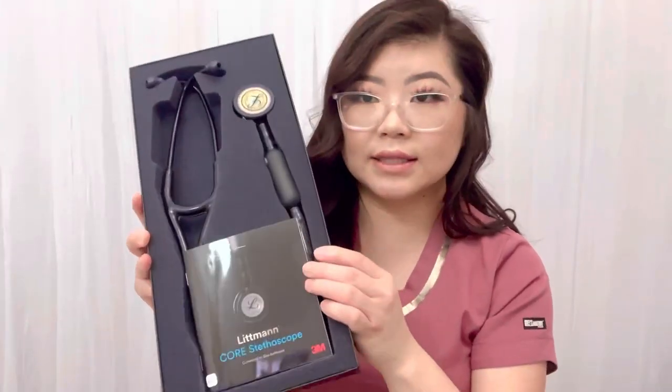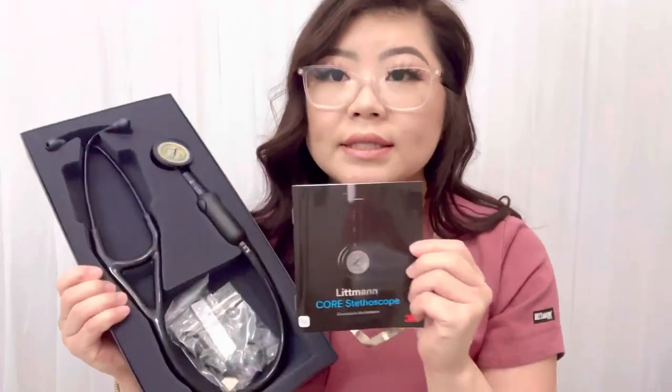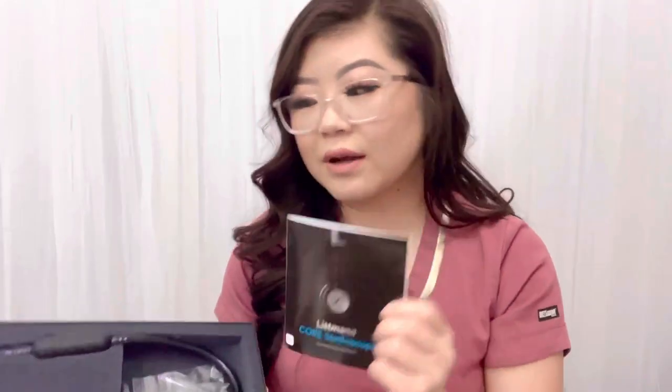When you open the box there's a little cushion cover and it looks like this. There aren't many colors to choose from — they're all going to be in black. The only color variation you can choose is the bell. I got the rainbow colored one. There's also all black, matte black, or silver, but I wanted the rainbow one so it'll be different from all the others.